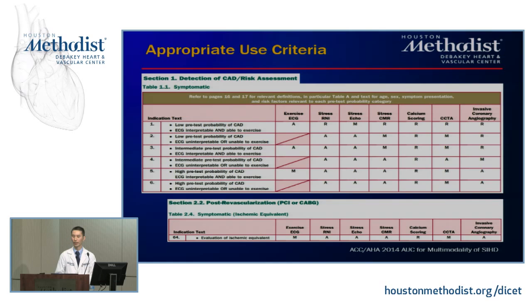But overall, in terms of appropriate use, you can see stress CMR made it in terms of being considered an appropriate modality for those who have intermediate pretest probability of CAD, and high pretest probability of CAD as well with uninterpretable ECGs.